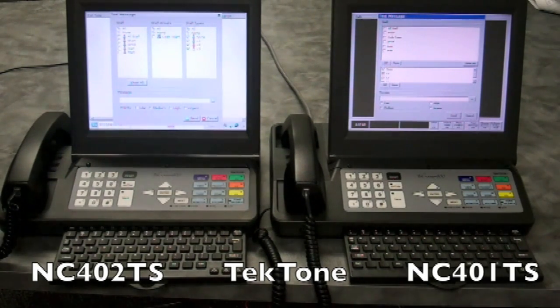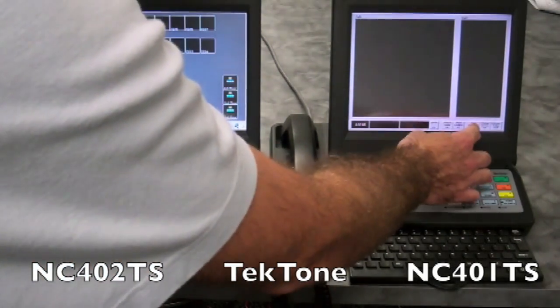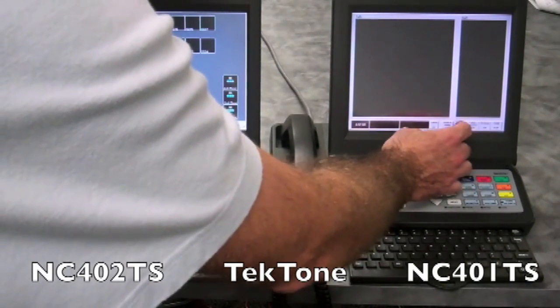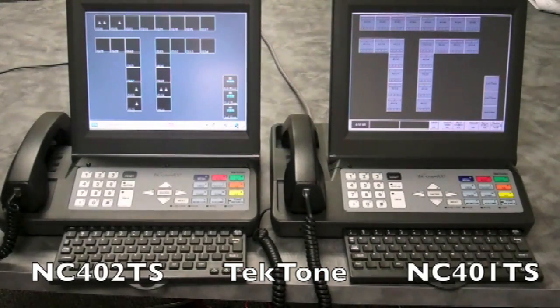The icon screen has also been drastically redesigned. The icons now use graphics with color to represent rooms, zones, masters, staff, and patients. Each room icon now shows the number of beds in a room as well as the type of staff present or requested.